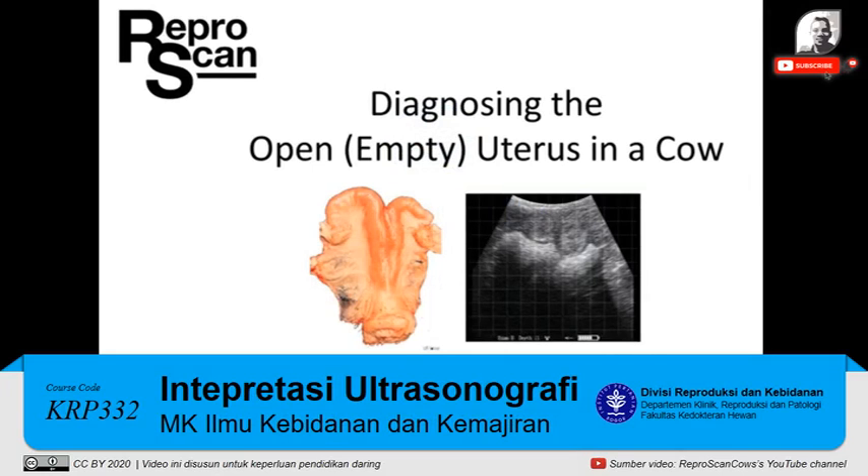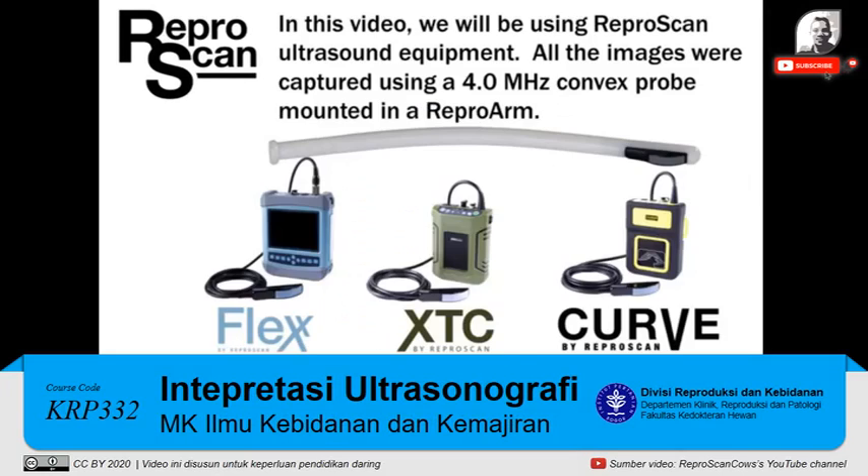Diagnosing the open or empty uterus in a cow. In this video we will be using ReproScan ultrasound equipment. All the images were captured using a 4.0 MHz convex rectal probe mounted in a repro arm.